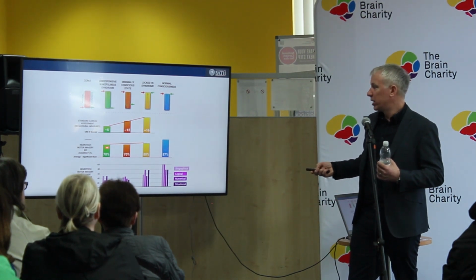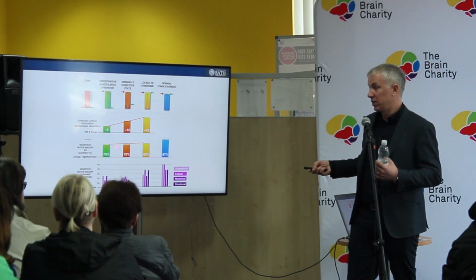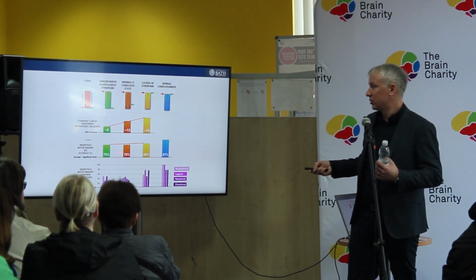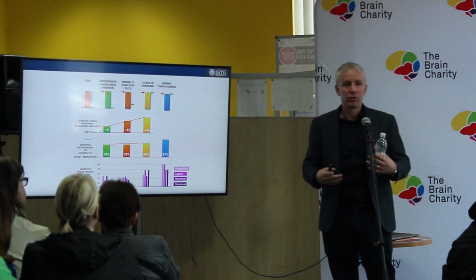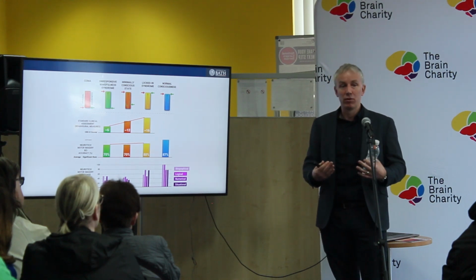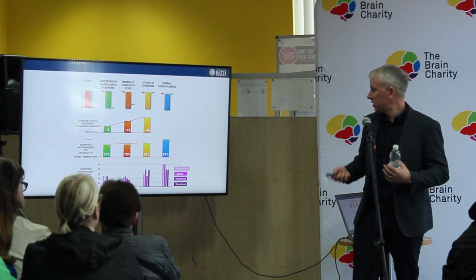Whereas with the brain-computer interface, we're not seeing much difference between UWS and MCS, which indicates maybe that the UWS are able to modulate brain activity just as well as MCS and nearly as well as LIS. I know this is a little bit hard to explain, but in general, with brain-computer interface, we don't see as many differences because it's not a behavioural response that's required to diagnose the patient. It's just a brain modulation.